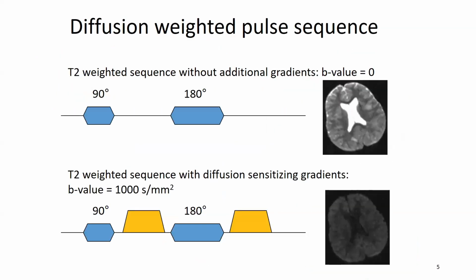Well, actually, it's quite funny because we measure something on a very short microstructure scale, in micrometers, but in MRI we are looking at much bigger voxels, but we'll come back to that later. We do have a T2-weighted sequence. You don't have to know much about that. Of course you know about a T2-weighted image. You've heard that from Joost. So this is a T2-weighted image, and you can get it with a normal T2-weighted sequence.